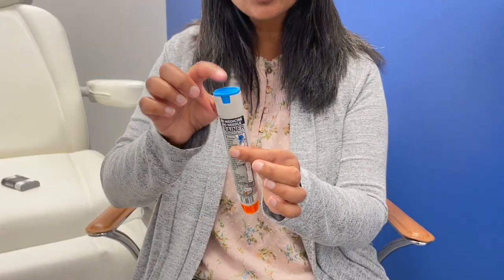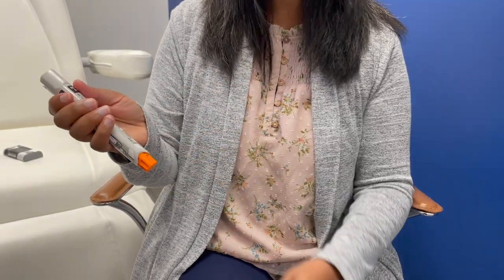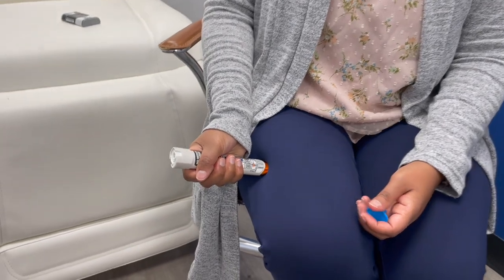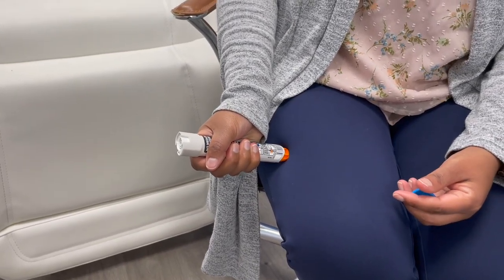Let's go over the EpiPen first. With the EpiPen, you have a blue safety guard that you'll have to remove, and the orange end contains the needle. You'll want to swing and hold it in place for about three seconds, allow all the medicine to go into your thigh, and then remove it.